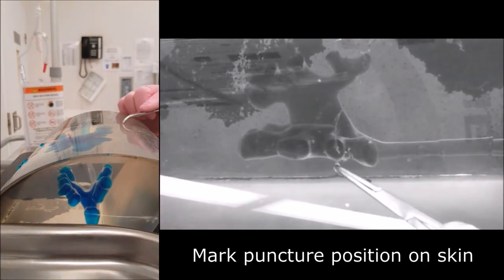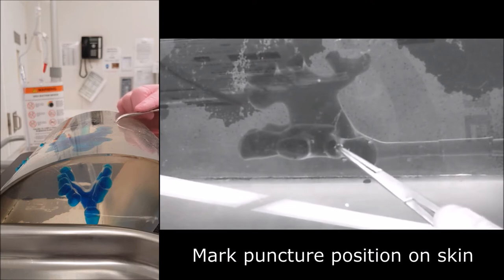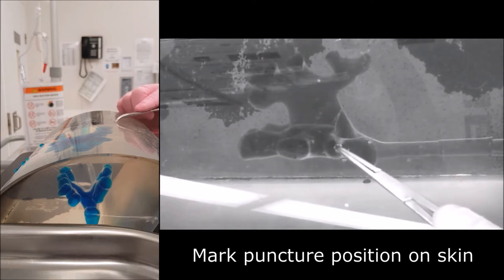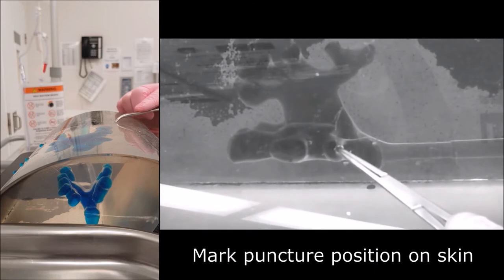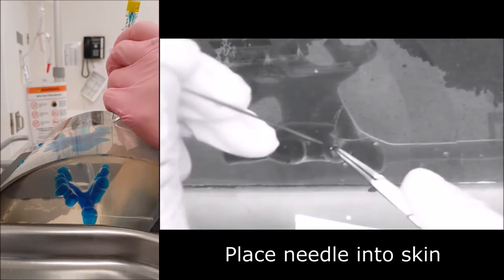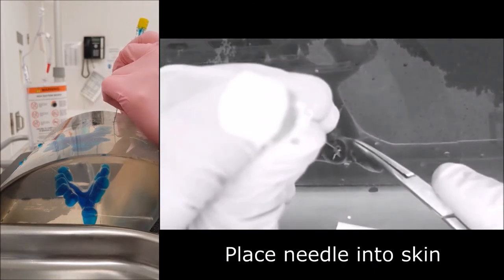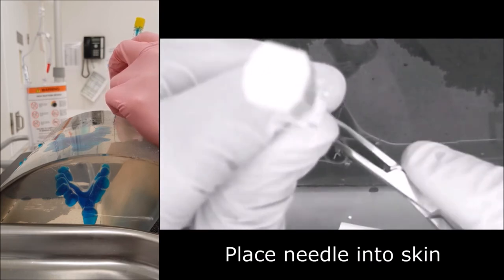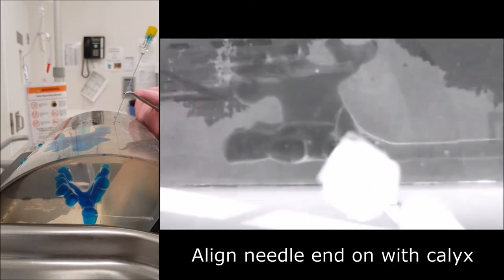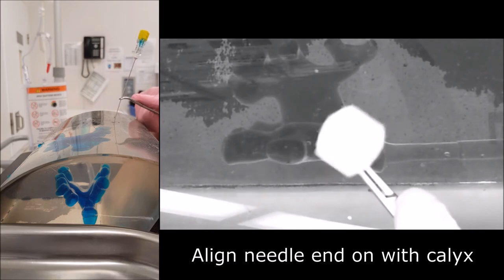Use the image intensifier to identify the puncture site on the skin. Place the needle slightly into the skin. Align the needle directly end-on to the calyx and the image intensifier.